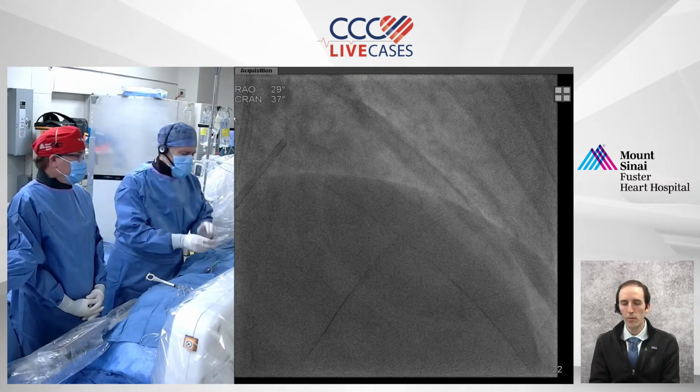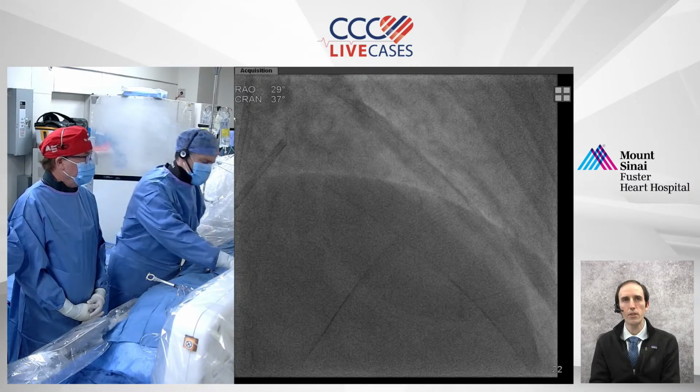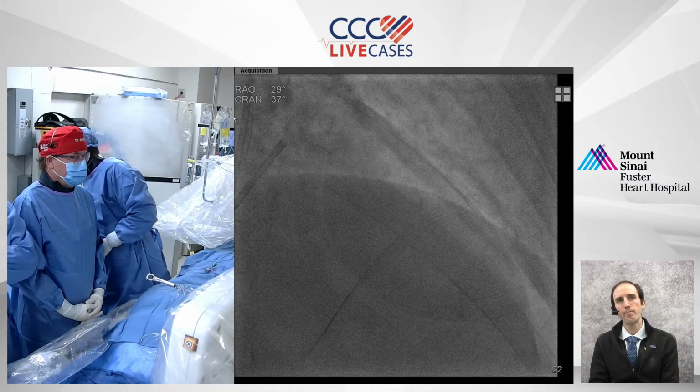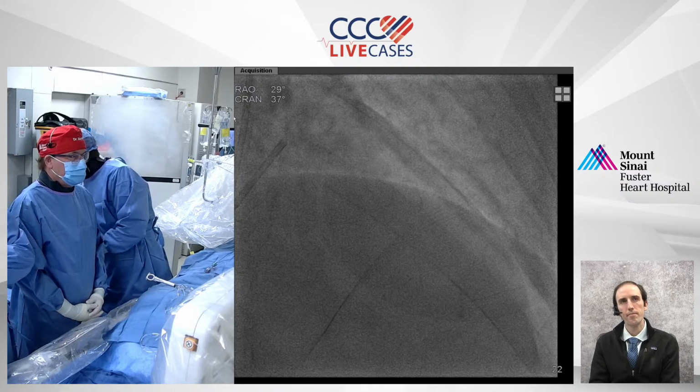Yeah, and so for that reason, at least in our practice, I think it makes sense to do these cases in a scheduled way so that you can hold all the necessary meds. And so ad hoc testing is a little bit less common. Yeah, exactly. So what I've done now is I've loaded.